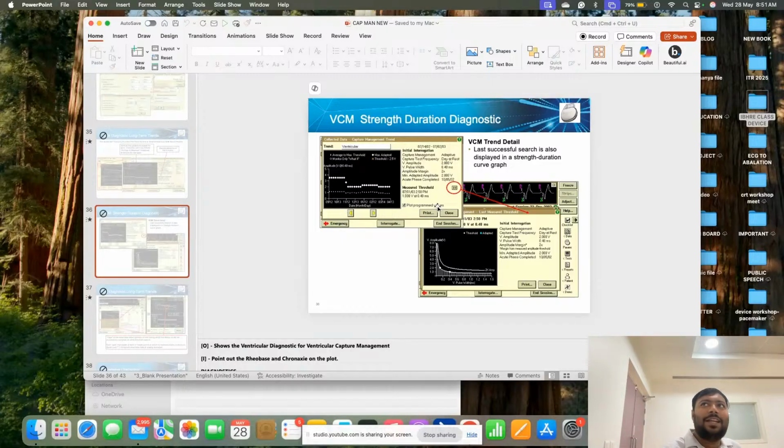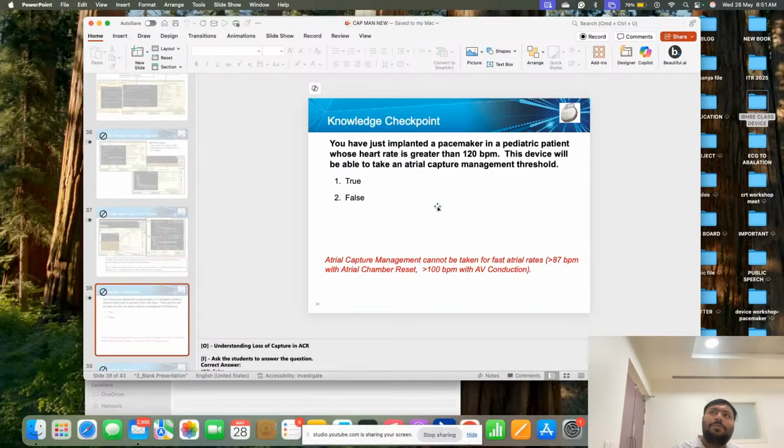So this time will be very useful, sir, to find out these kinds of things. So this is all about capture management, sir.